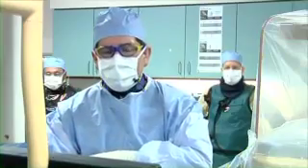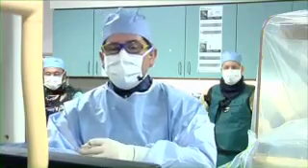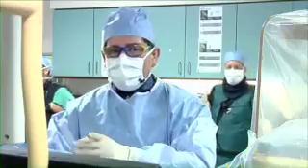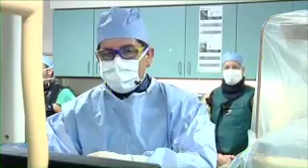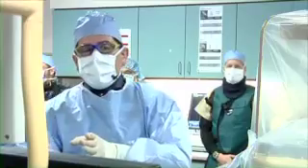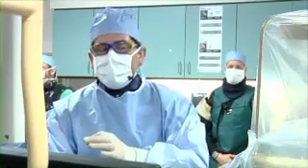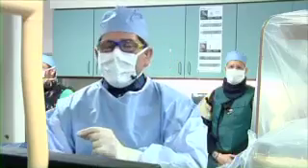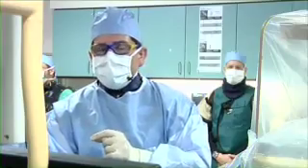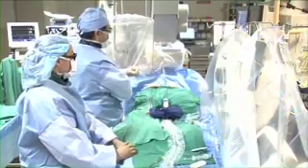And the other part of the question was whether to replace it. No, they're not going to be replaced. Sometimes what happens is that you can miss another defect. Well, you shouldn't, but occasionally it could happen. And then you have to come back and close it with a second device. But that is rare. In the closure trial, using not this device but another device, there was an 85% closure rate, less than 90%. What does that mean? It means that about 10% of patients still have mini shunts on follow-up. That is very specific to the device that was used, but I think with the new generation of devices, that's very rare.